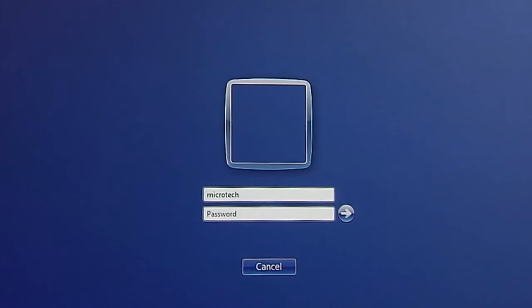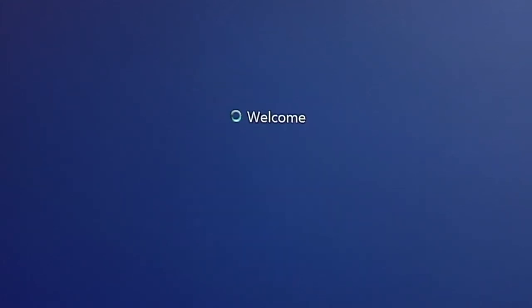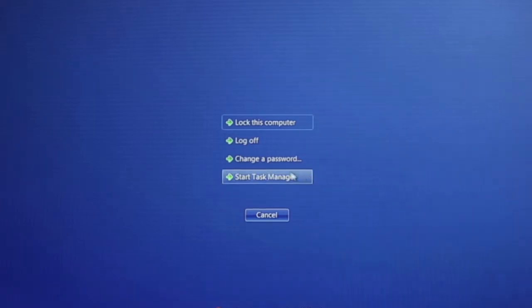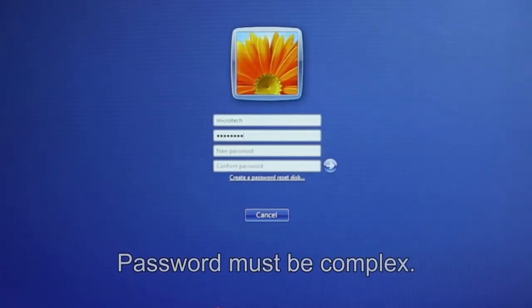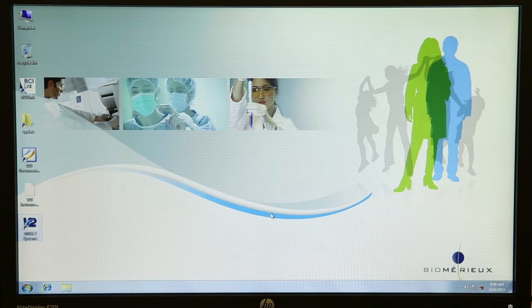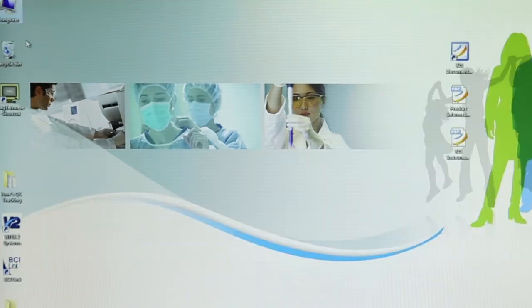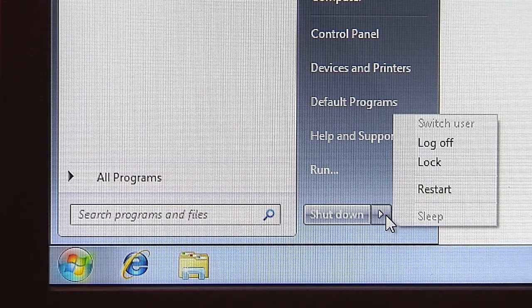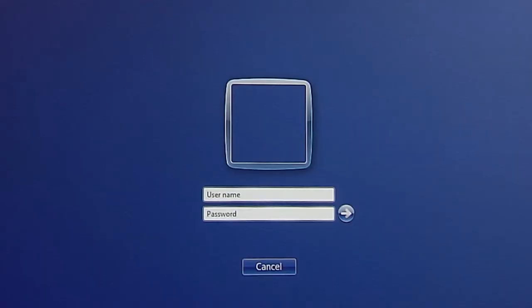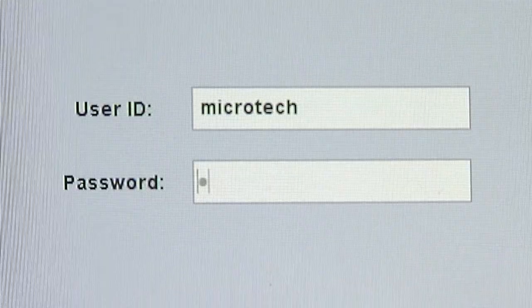Changing Password. Log in to the Windows software using your user name and current password — Microtech. Press the Control-Alt-Delete keys at the same time to display the security window. Click on Change a Password. Type in the old password. Type in the new password and re-enter it to confirm. Click OK. To access the system using the new password, log off the computer. Click on the Start button in the lower left corner and click on Log Off. Press Control-Alt-Delete. Log in to Windows using the new password. Log in to Vitek 2 system software using the new password.